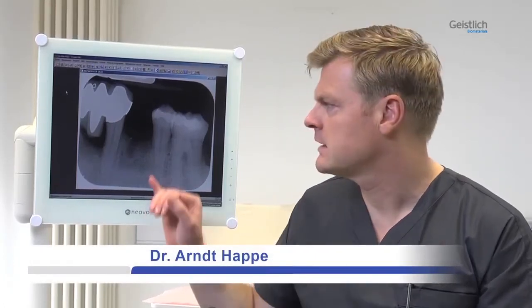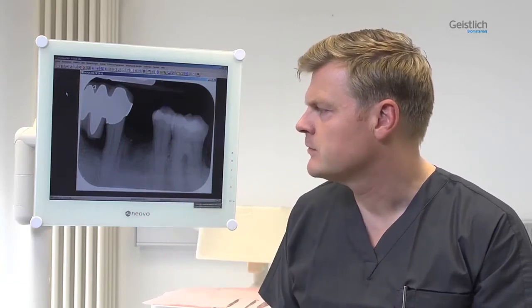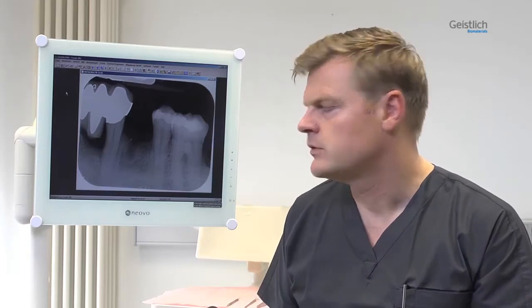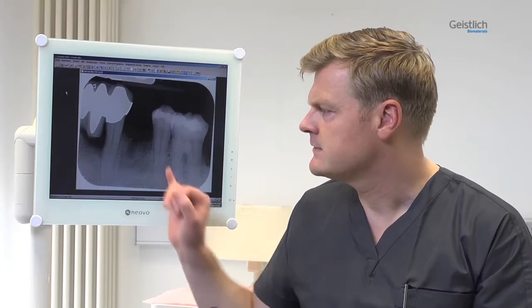2 months before the present intervention, tooth 3-4, which had been endodontically treated in the past, needed to be extracted. In the course of this treatment, the apical tip of the tooth was resected. Site 3-4 therefore exhibited corresponding scars on the vestibular side. A moderate alveolar ridge defect is recognizable in the radiograph.